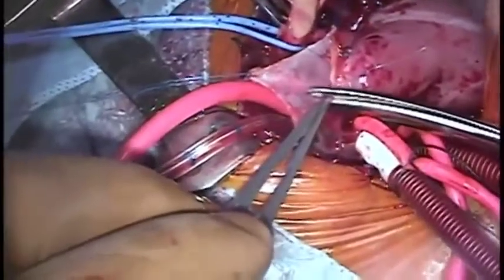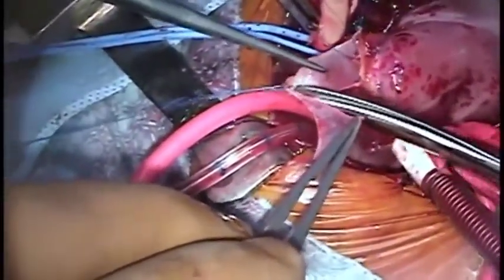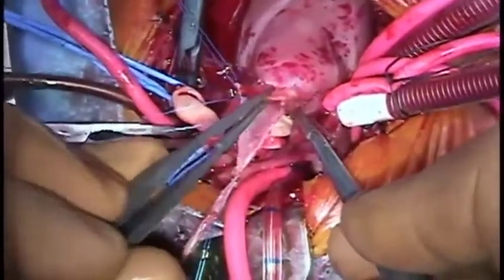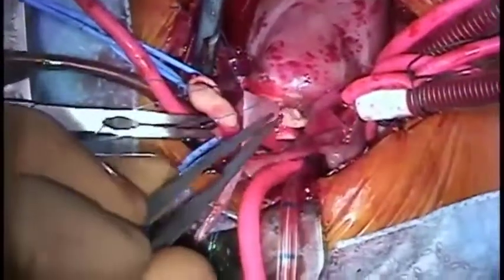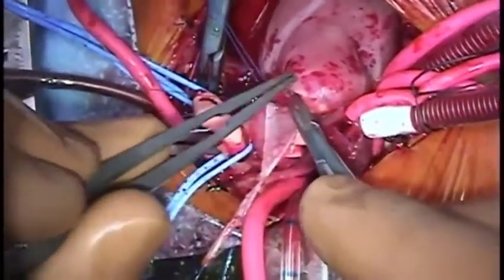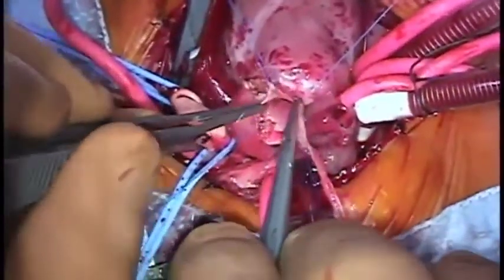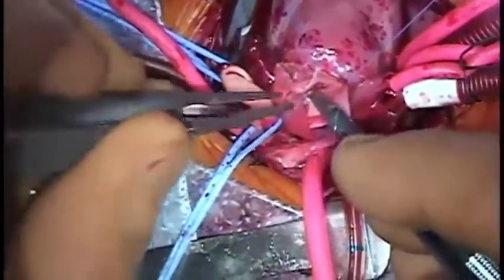We now return to the nearest corner. The pericardium is trimmed. The scissor cut is angled towards the surgeon in order to prevent excision of too much patch. Once the nearest suture line is completed and tied, the commissural post is resuspended within the pericardial tube using a U-stitch. The excess tissue above the valve is trimmed off.